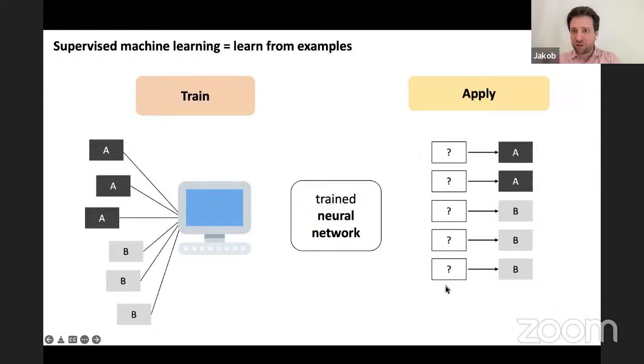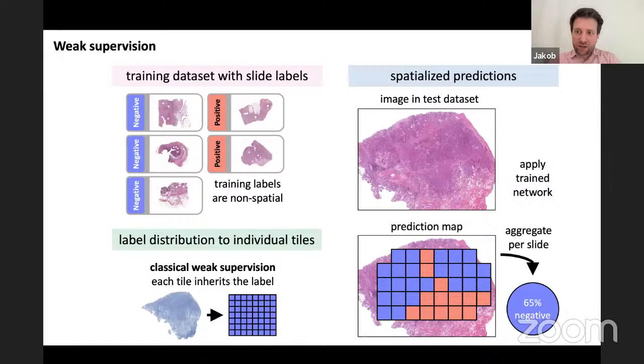And the way we apply this in computational pathology is very, very simple. We just take this approach and put it into larger methods pipelines that allow us to process these large images, as Pete has shown. If you scan a whole slide, you get really, really a lot of data.